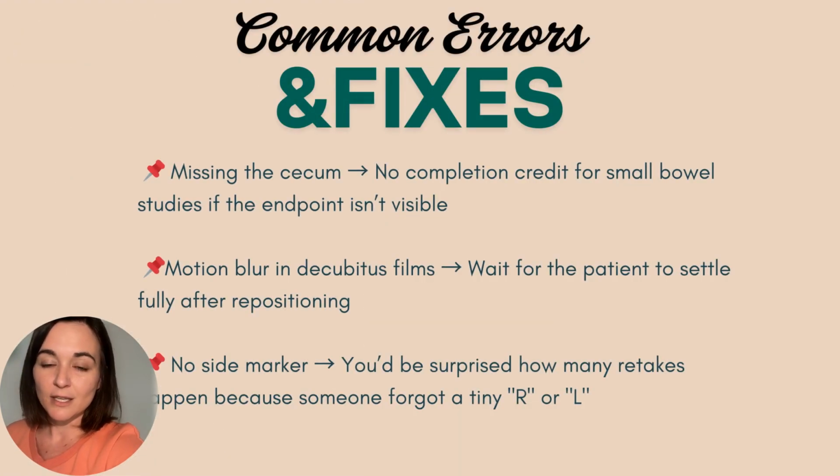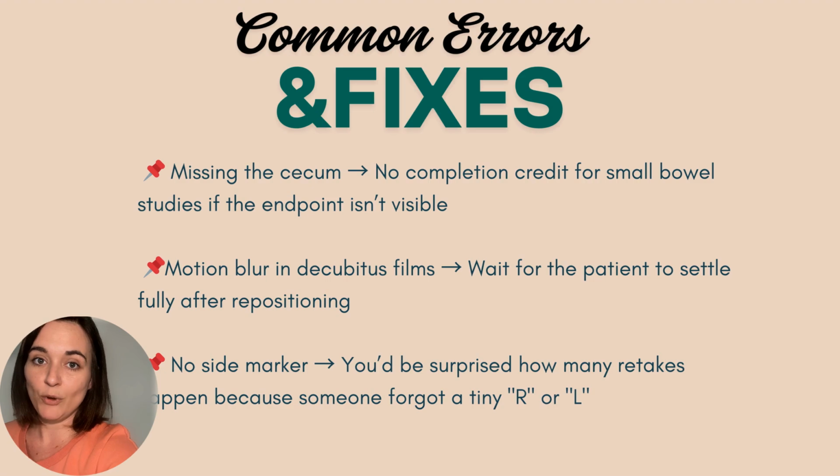Common mistakes: image review missing the cecum, no completion credit for small bowel studies if the endpoint isn't visible, motion blur in the decubitus, wait for the patient to settle fully after repositioning, no side marker. You'd be surprised how many retakes happen because someone forgot a tiny R or L.